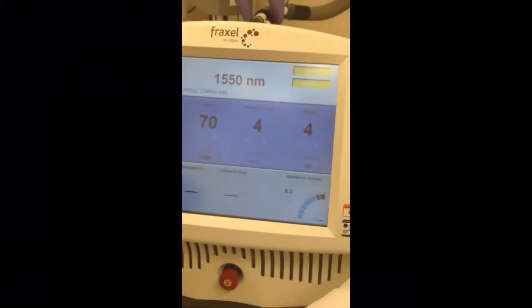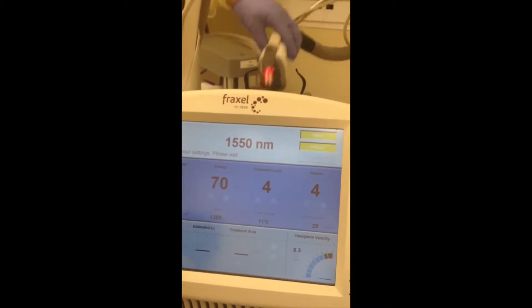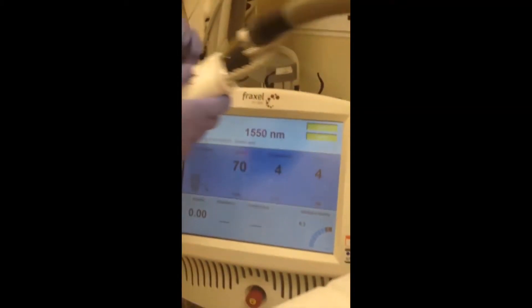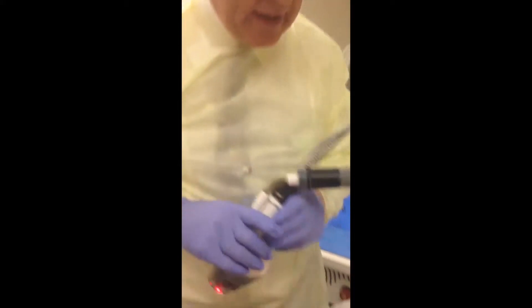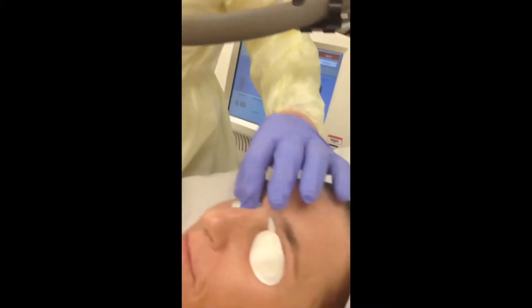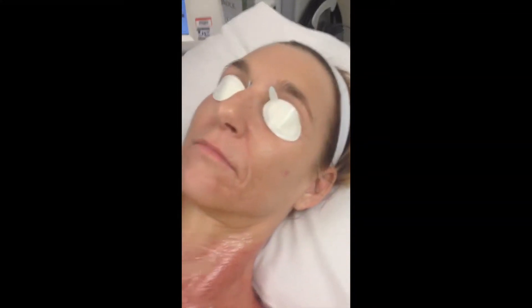We're going to press the Ready button. We've got our device, it's all secure, and we're all wearing appropriate glasses. She has appropriate gear on and she signed her photo consent form, so we're all set to go.